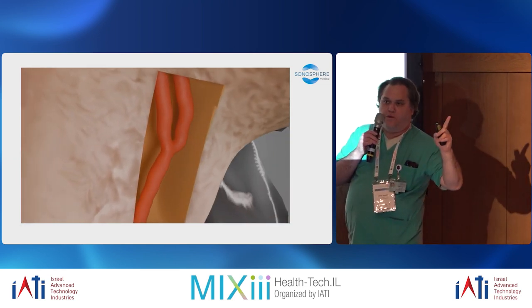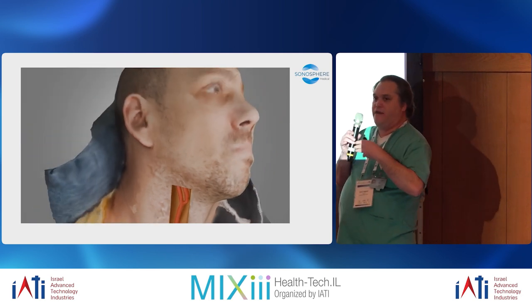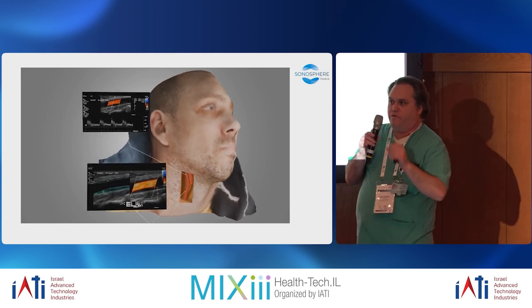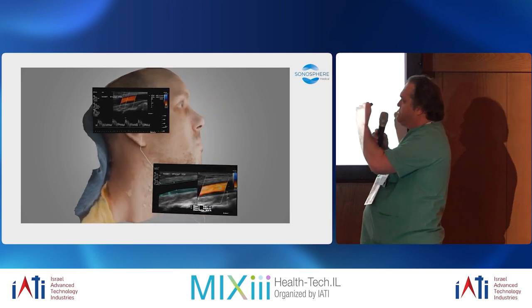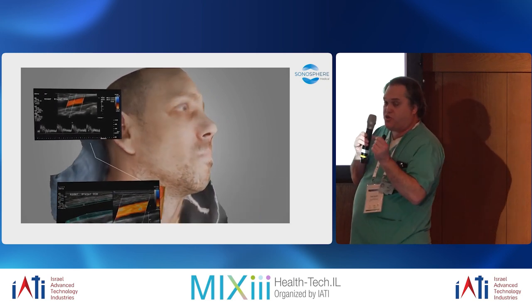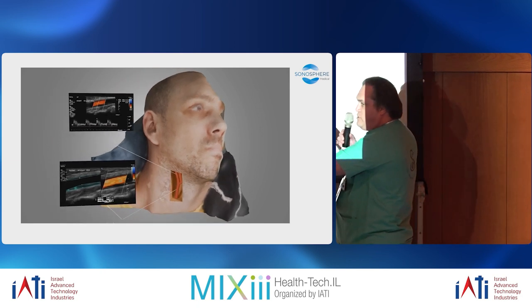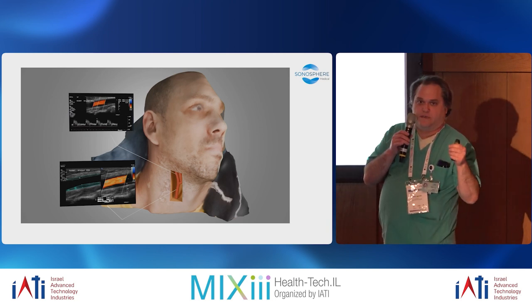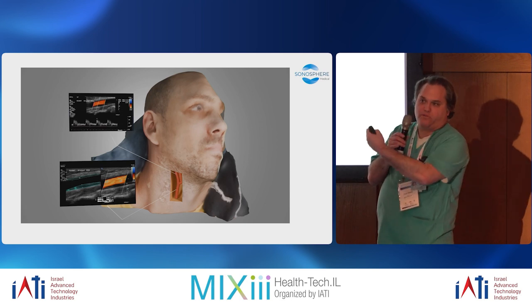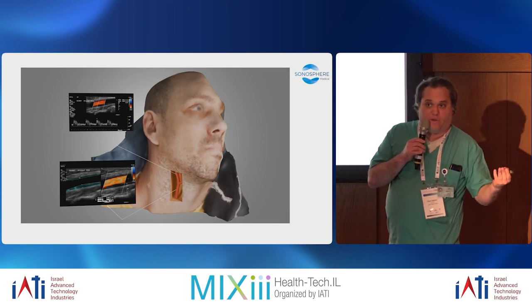In generation one, we want to give the physician, the operator, a landscape of the artery, focusing on a few places in the artery that have important information about the velocity. Here we decided upon the internal carotid and the common carotid, with very important velocities that, for me as a surgeon, will aid me in deciding whether or not to operate on Avi, and to follow up after the operation.